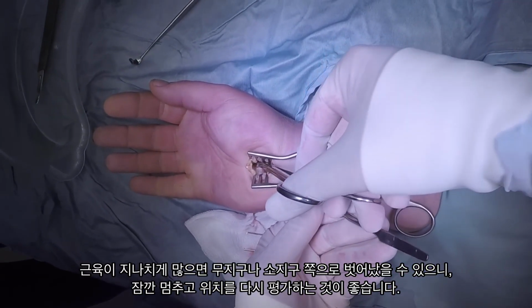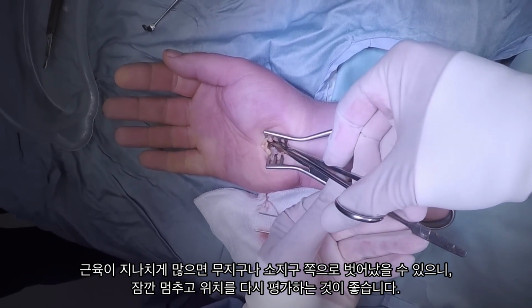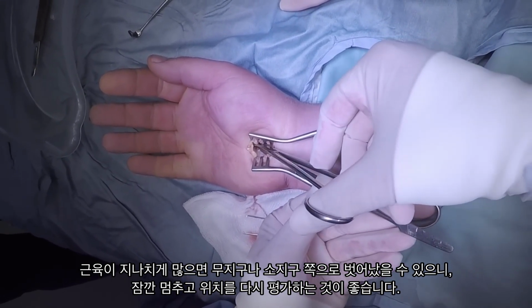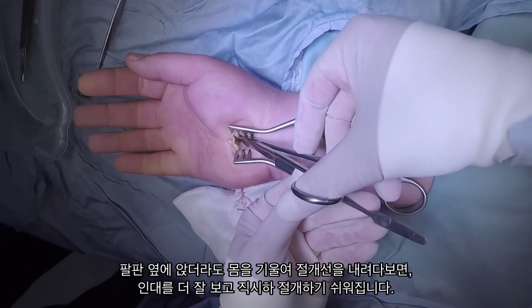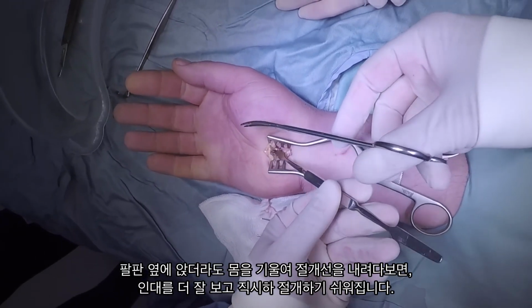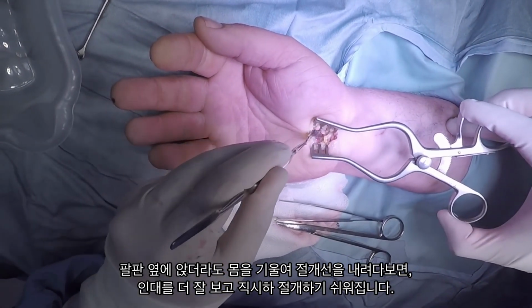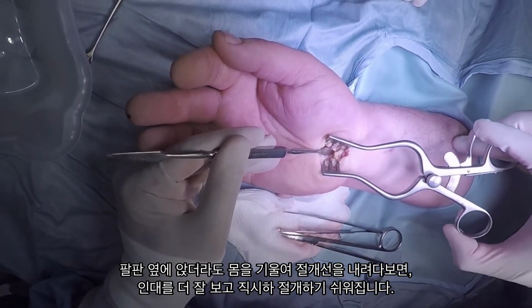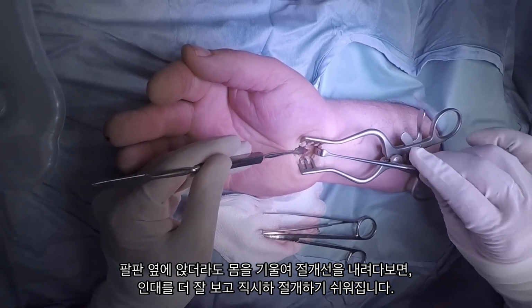The last point worth mentioning is your own positioning. I mentioned at the start that some surgeons sit at the end of the armboard looking along the axis of the arm, but if you do choose to sit on the side of the armboard as we are here, it does help to lean or move around a bit and look down your incision, because you can often see the ligament a bit better and divide it under direct vision, as you can see here. You should still check with the McDonald, as we demonstrated earlier, but it can make things easier.